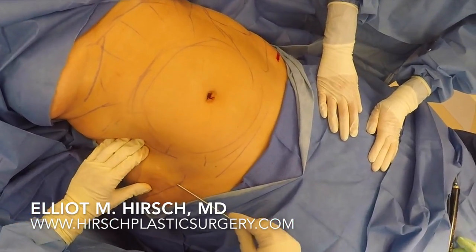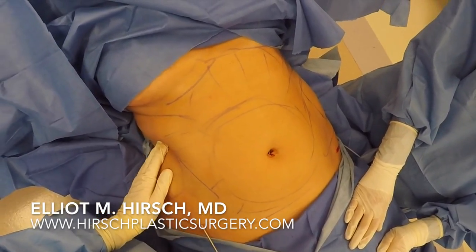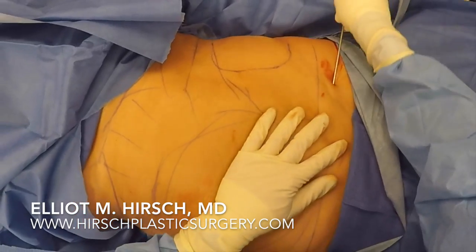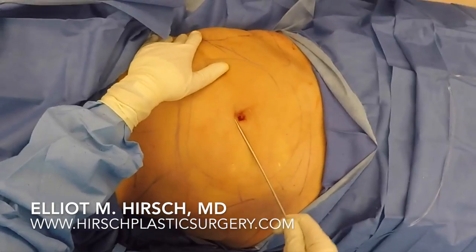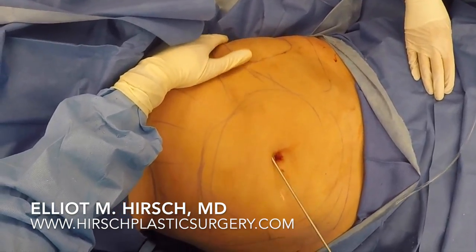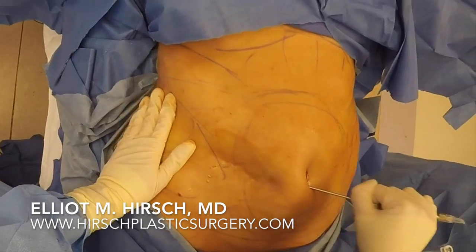The first step in this technique is to infuse a large amount of dilute local anesthetic solution into the planned areas that will be liposuctioned. This will help keep pain under control during the procedure and will also make it easier to remove the fat. The fluid infused into the patient contains saline, local anesthetic, and epinephrine, which will minimize bruising postoperatively and help keep the patient comfortable during the procedure.